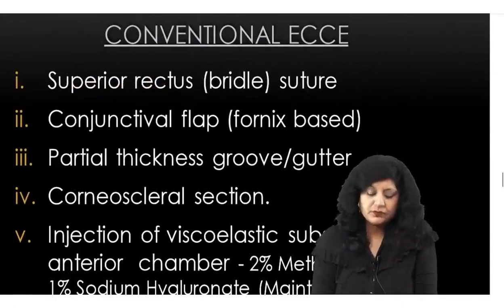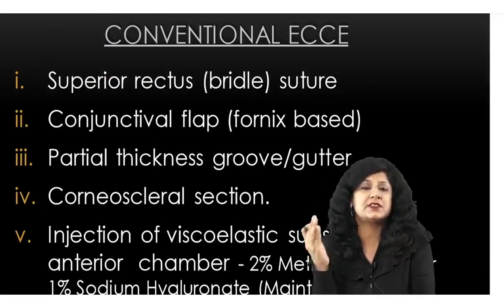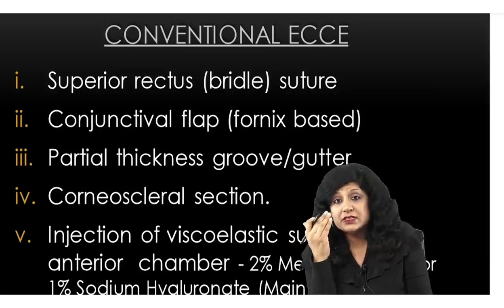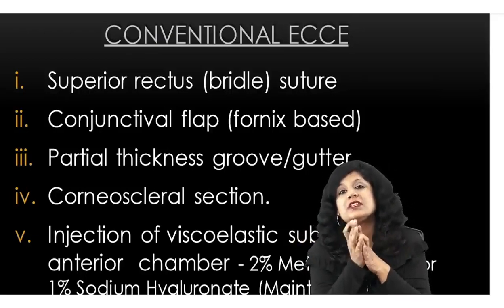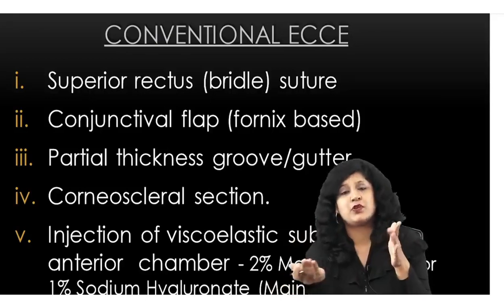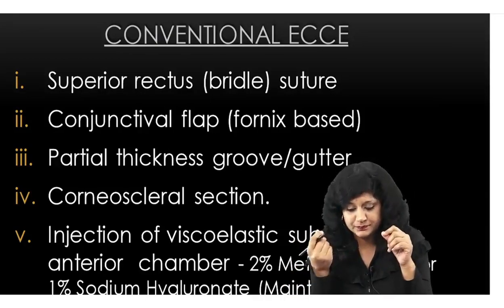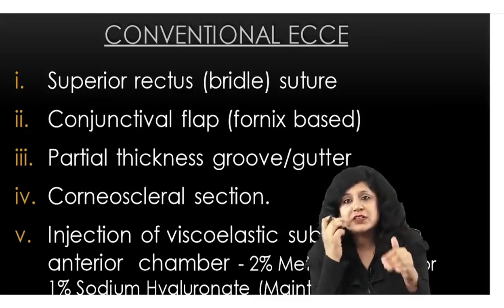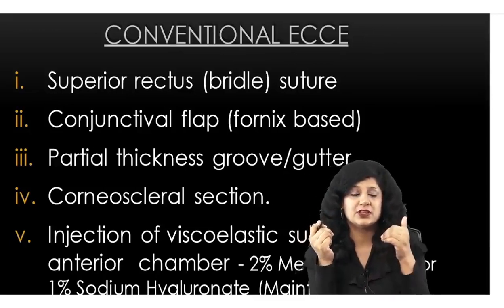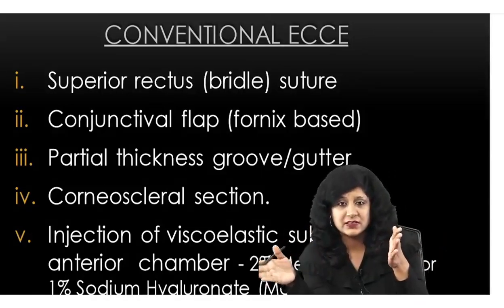Now, I will be telling you first the conventional ECCE steps, because this is the basic surgery that we are doing. So, you should know these basic steps as a beginner also. If you are starting in your college, when the examiners, your seniors or the consultants, will give you the case, they will be giving you the simple steps from this surgery. Nobody is offered the total cataract surgery as a whole, so you are first doing the simple steps.